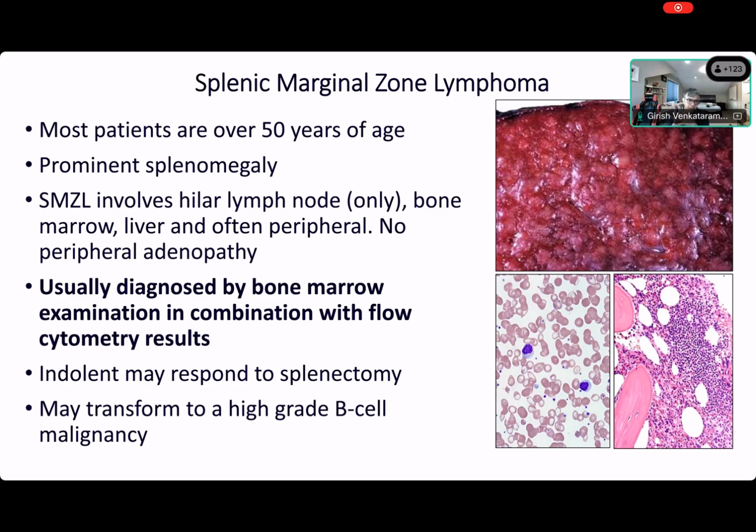So these are the patterns you look for. Is it paratrabecular? Is it interstitial in the marrow? And if it's interstitial, is it also sinusoidal, right? Especially only inside the sinusoids. And is it exclusively sinusoidal? That's also important to know, right? So we make these deductions based on what we see.